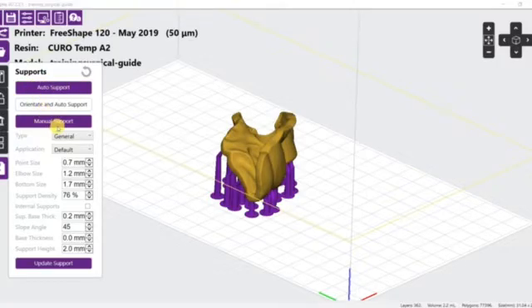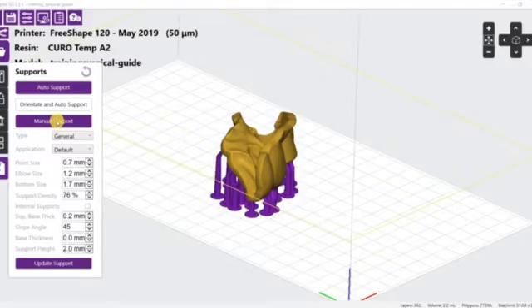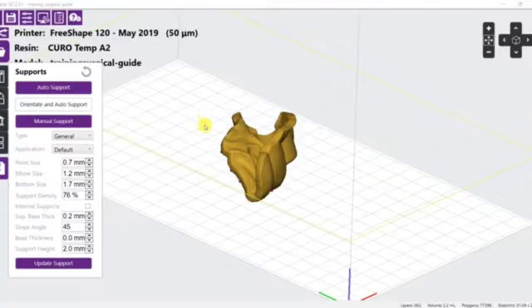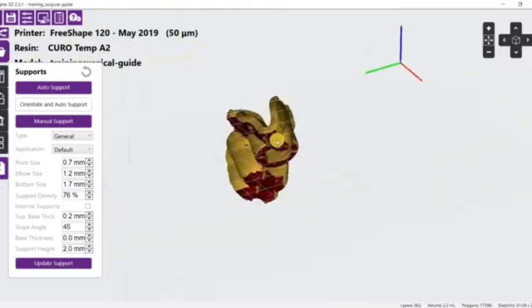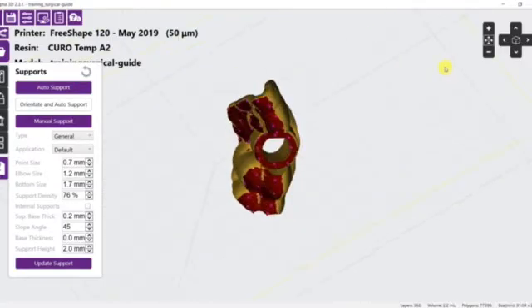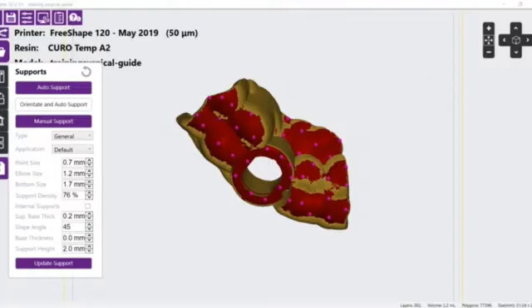Even though this function is mostly automatic, you may still sometimes need to manually add or remove some of the supports. Here is an example.